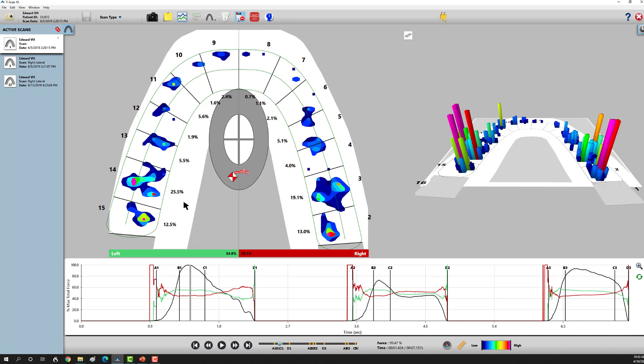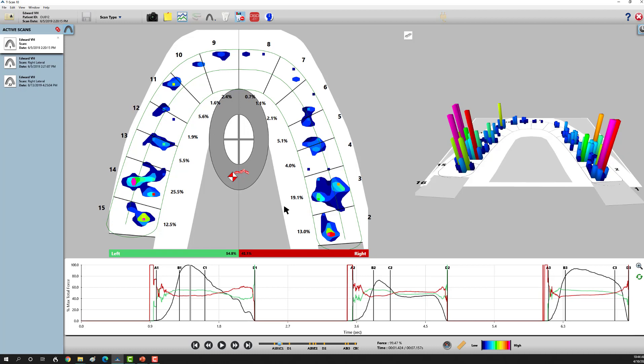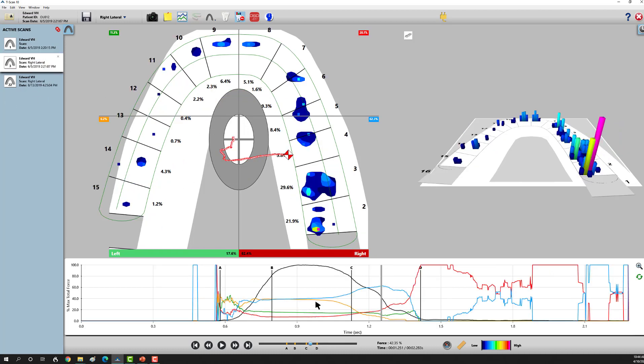The knee-jerk reaction is you're just brushing too hard—go to a soft bristle, use the modified bass technique, the things I learned in dental school. Let's look at a right excursive movement.